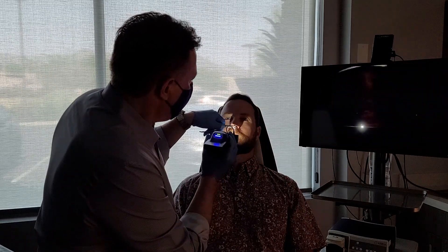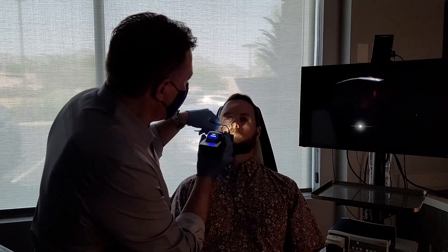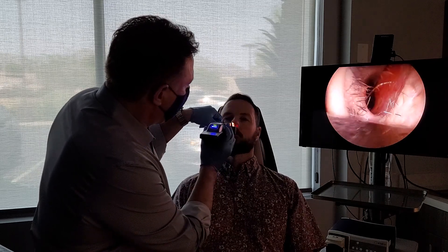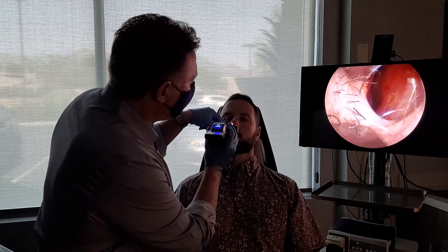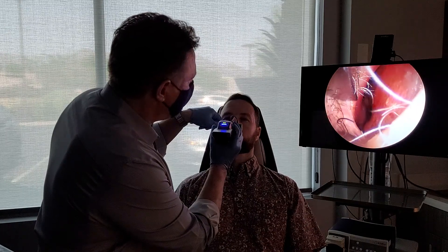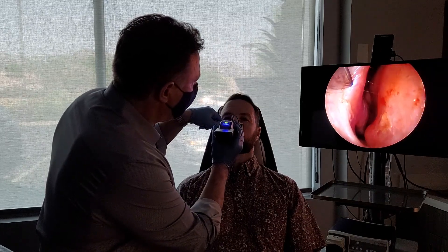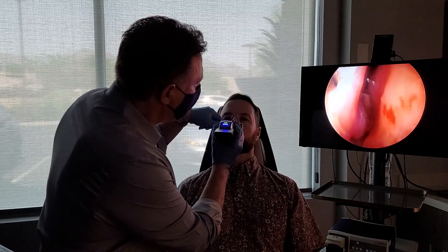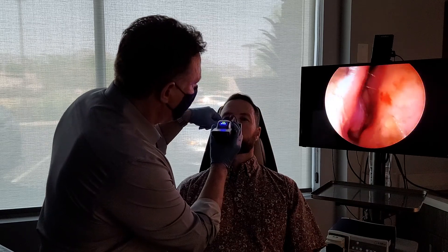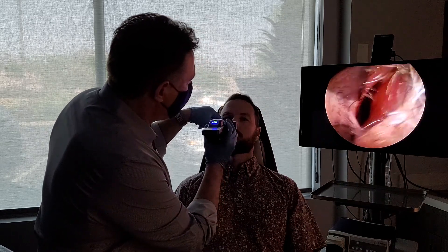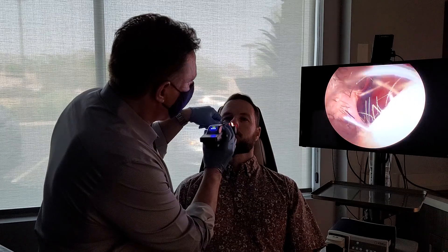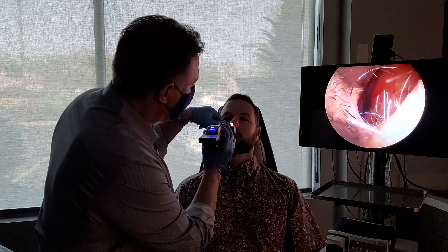I'm gonna go ahead and view the opposite side. This is Kevin's right nostril when we open up. Looking inside his nasal cavity, I can see his septum, his inferior turbinate, and right back a little bit farther is the middle turbinate. But once again, this is what I would see if I look inside Kevin's nasal cavity without the scope.